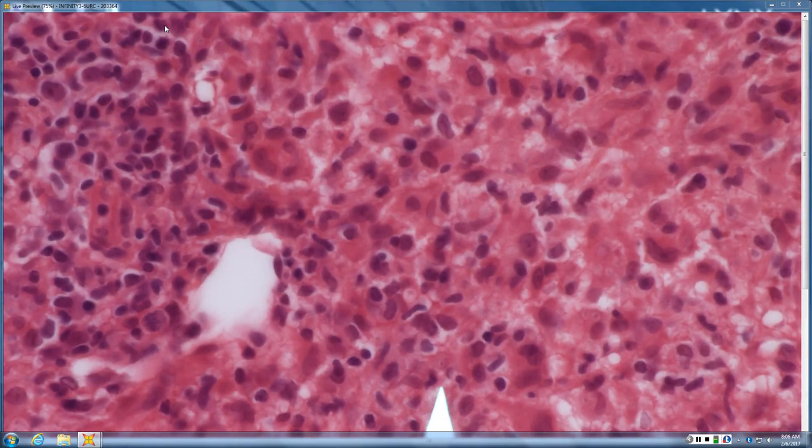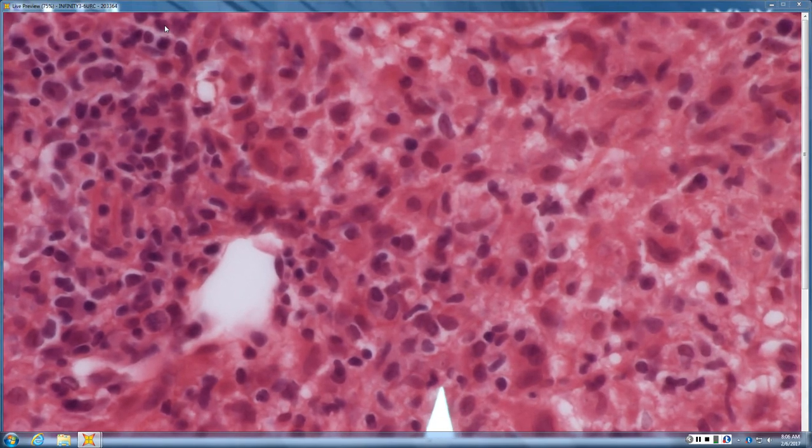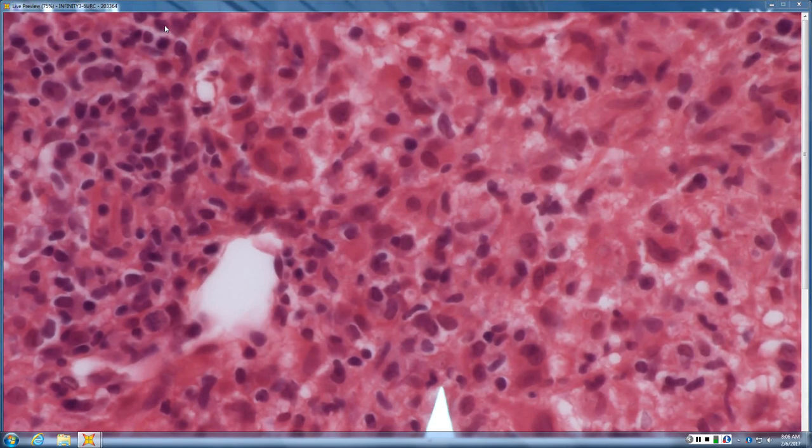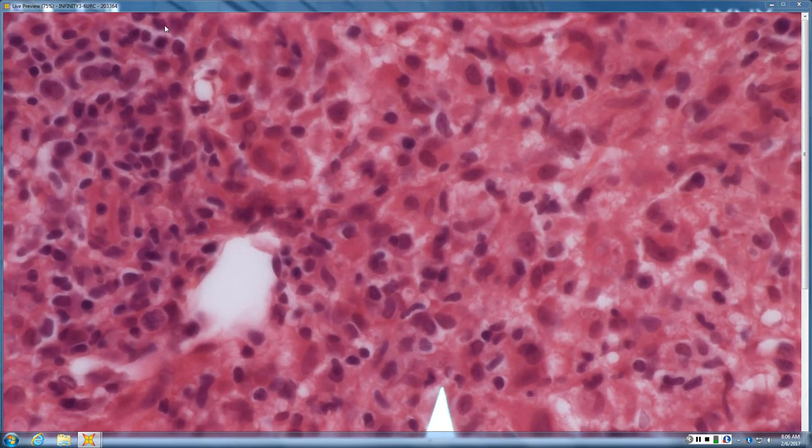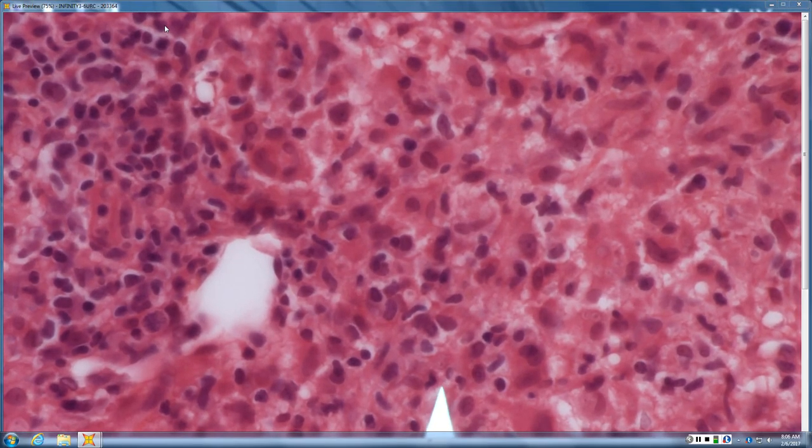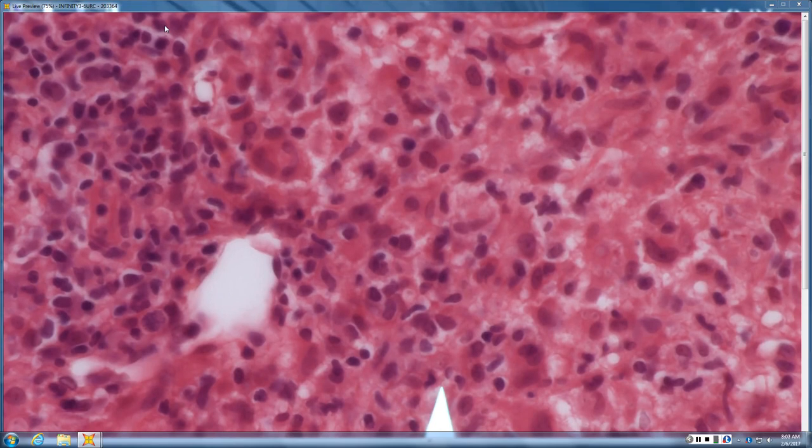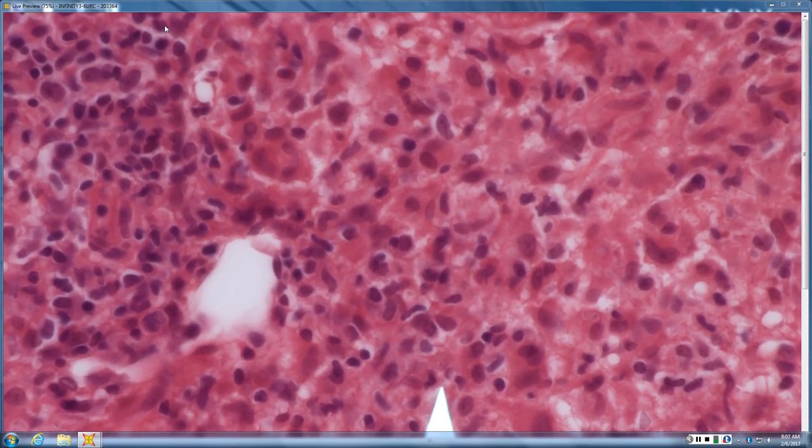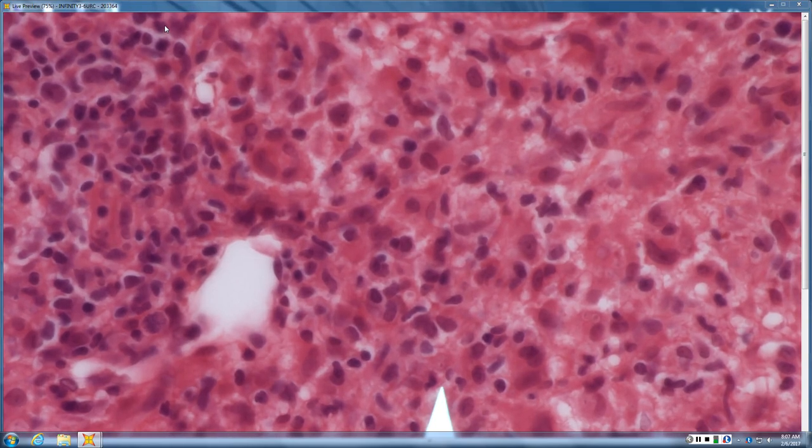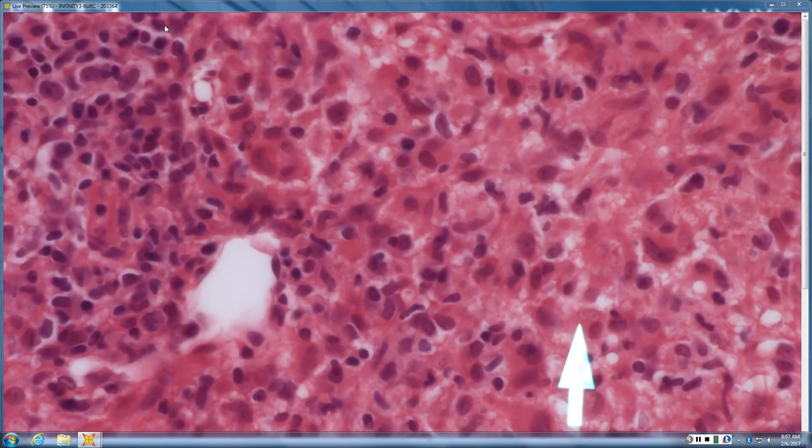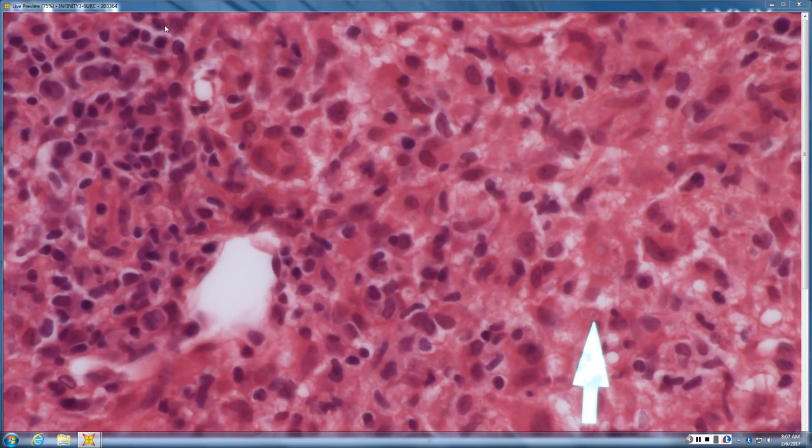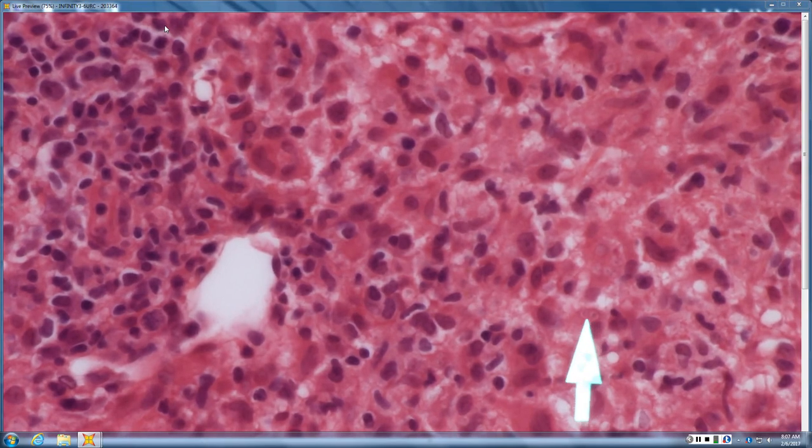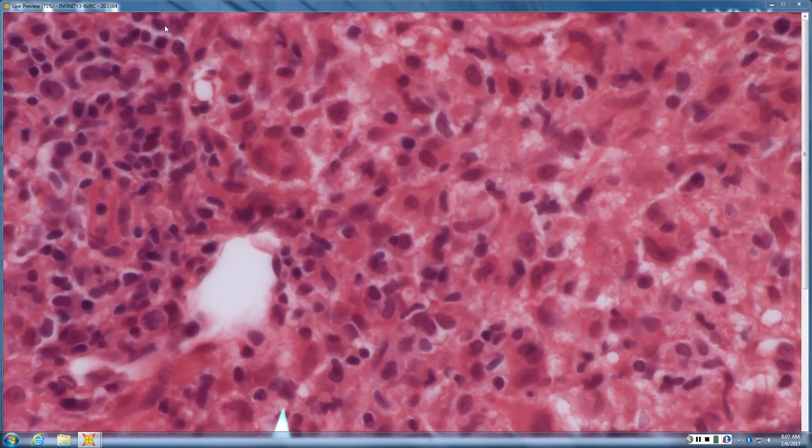These are a little small, maybe, for cryptos, although you can get fooled, because cryptos gets really small when it's granulomatous. If you look at the one right by the tip of the arrow, up on the screen, you can see... Yeah, it has a blue organism and then a little white halo around it, a little white pseudo-capsular halo, which is good for histoplasma.